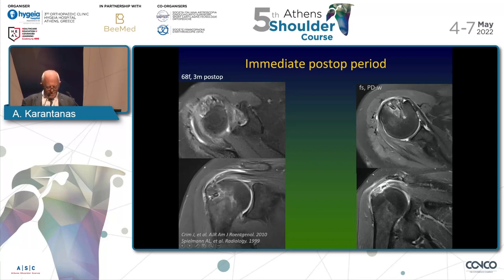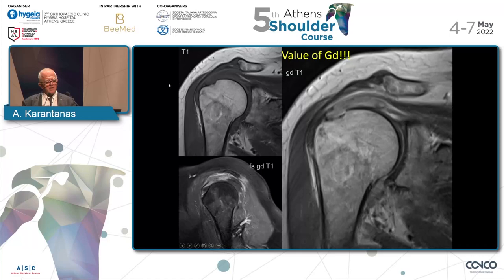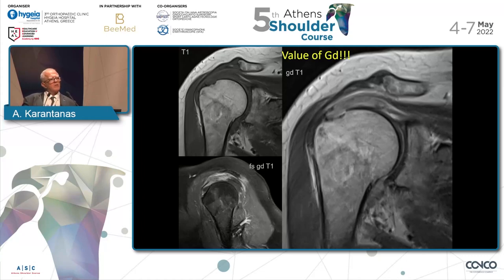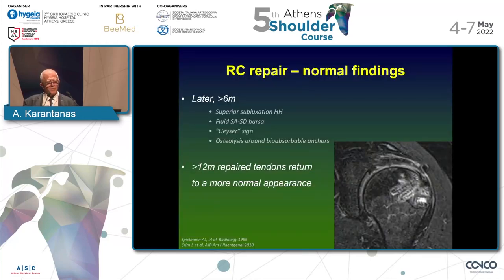How can we overcome this drawback of magnetic resonance imaging? We need to inject contrast, and we need to remember that only 10% of asymptomatic patients after a repair have a normal tendon on MRI. This is an abnormal signal within the supraspinatus tendon on T1-weighted images. After contrast injection, we see intense enhancement on oblique coronal and oblique sagittal fat-suppressed images. Intense enhancement is normal — that's the normal reaction of granulation tissue following rotator cuff repair.